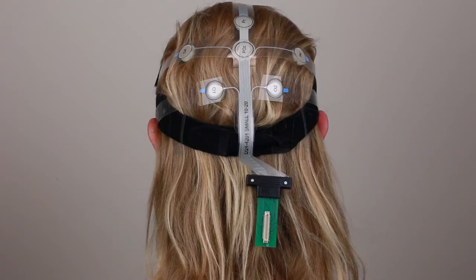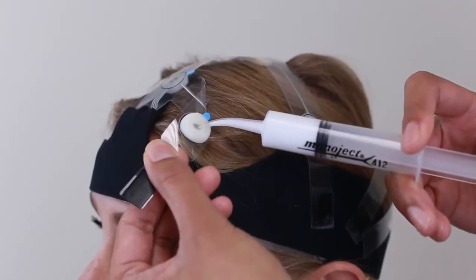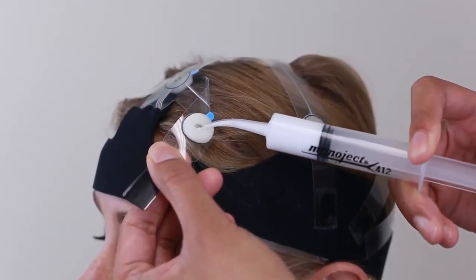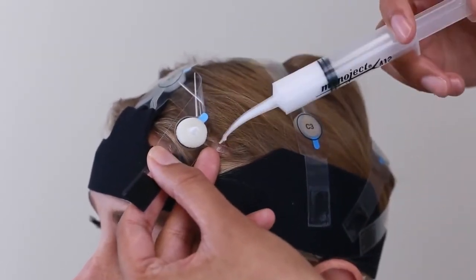Once all the strip arms are fastened to the strap, ensure that all foam sensors are lying flat against the head and are slightly compressed. Please note that excessive pressure can have negative effects on both signal quality and participant comfort. The ideal fit of the strip is achieved when all arms converge at the same point. It is now time to refill and position the remaining foam sensors on top of the parted hair to give the best scalp to sensor connection. One at a time and working front to back, lift the strip arms to the corresponding sensor site, part the hair with a syringe and fill with Synapse Cream.